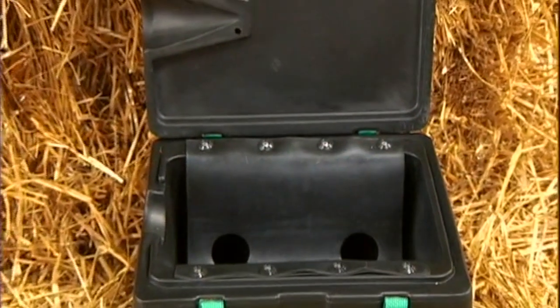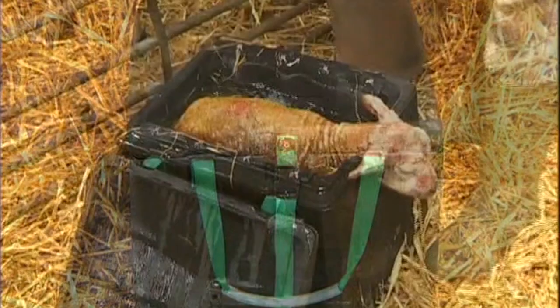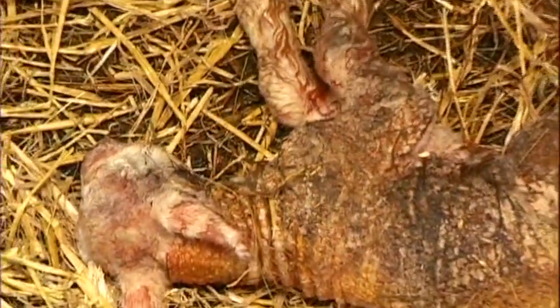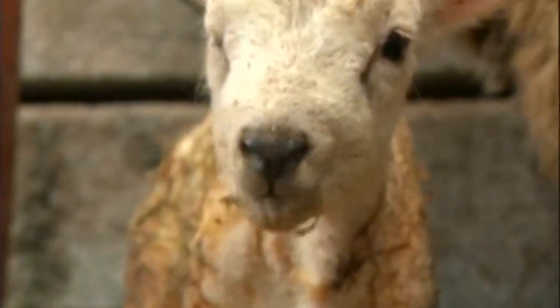A simple way to warm hypothermic lambs is the Woolly Warmer. Built from strong plastic with tapered sides, it is robust and stable when used in the pen. Newborn lambs get cold very quickly and are unable to stand or suckle, and will die if not warmed thoroughly.